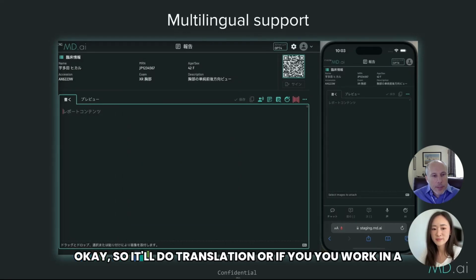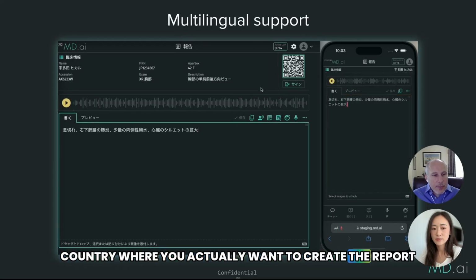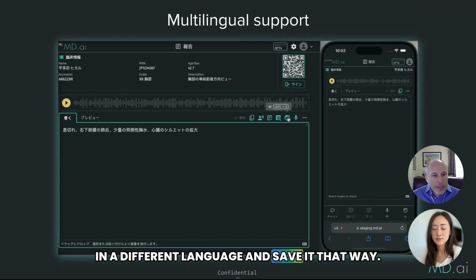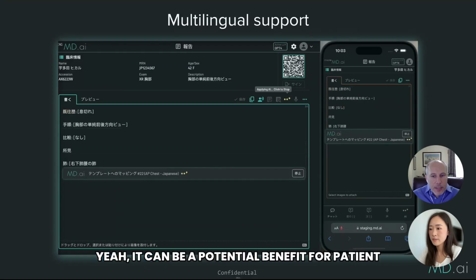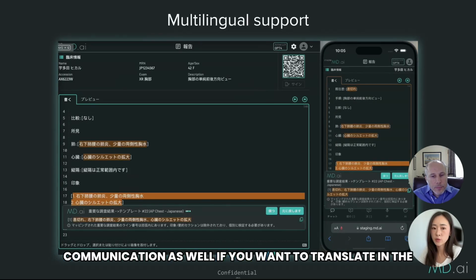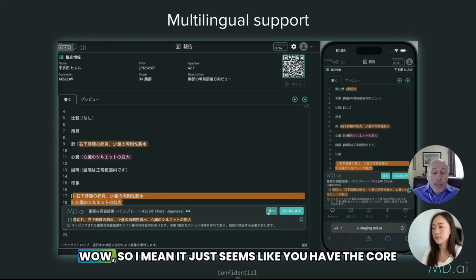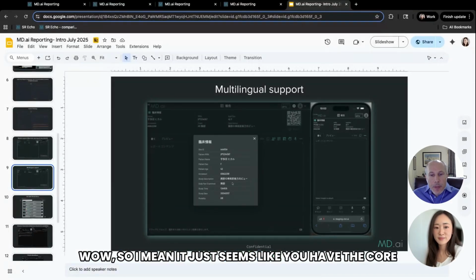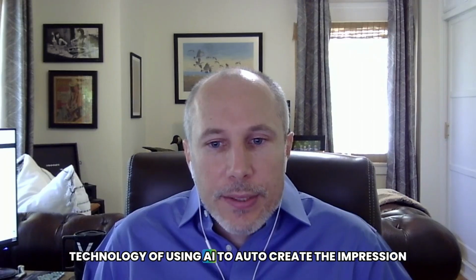Oh, okay. So it'll do translation, or if you work in a country where you actually want to create the report in a different language and save it that way, it'll do that as well. Yes, for sure. And yeah, it can be a potential benefit for patient communication as well, if you want to translate into the patient's native language.